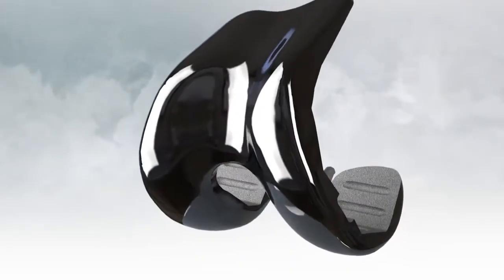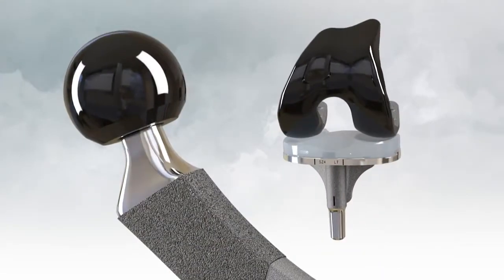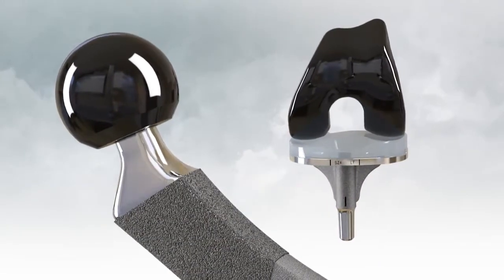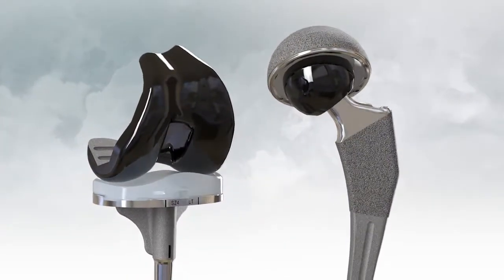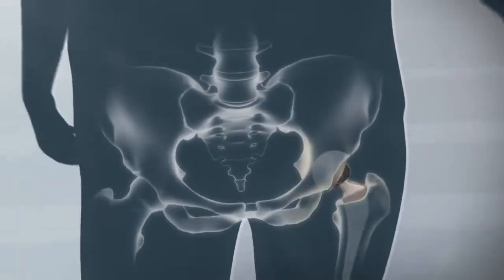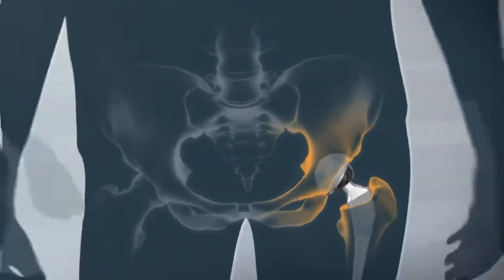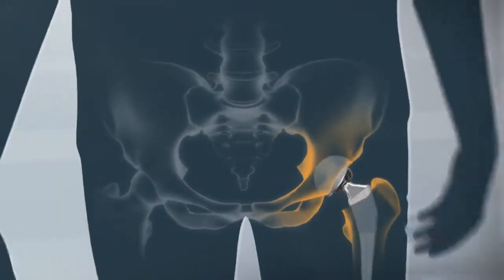Next, Oxinium implants are strong. As two of the largest joints in the body, our knees and hips are subjected to tremendous pressures even during routine, everyday activities. For example, the weight pressing against these joints during a simple walk can be five to six times your natural body weight. Because Oxinium implants are metal, they can easily withstand forces far greater than these.